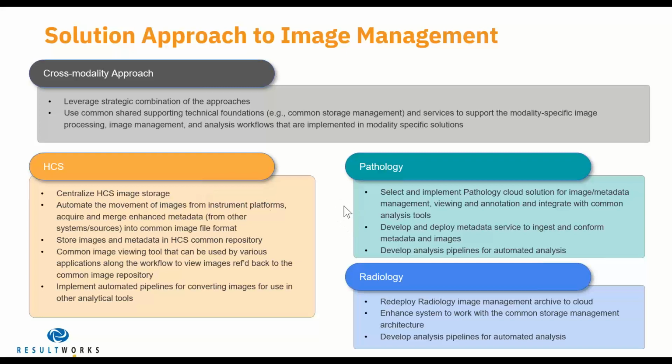On the pathology side, we were able to select and implement a pathology cloud-based solution for image and image metadata management, viewing and annotation. And we were also able to develop and deploy metadata services to ingest and conform those images and image data. And again, we were also able to develop some analysis pipelines to access the analysis tools around pathology type imaging.